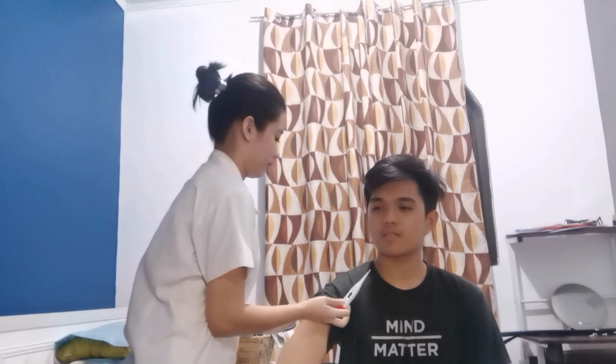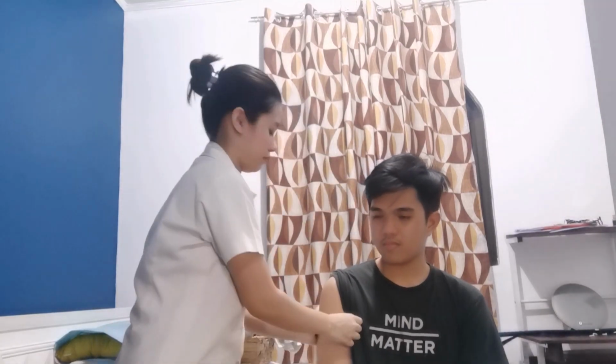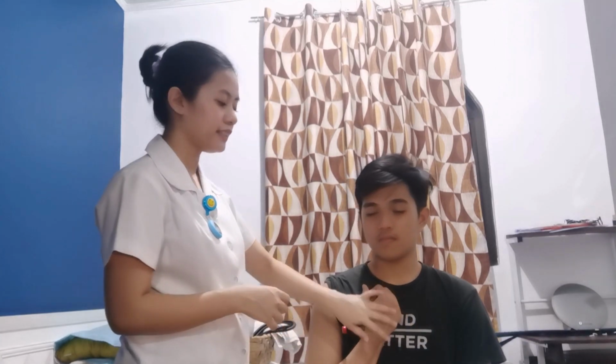In getting axillary temperature, we will use a digital thermometer. The first step is to place the thermometer in the center of the dry axilla to ensure accurate reading. Next is to ask the client to hold the arm tightly against the chest, and the arm may rest on the chest. Then leave the thermometer in place until you hear a beeping sound.